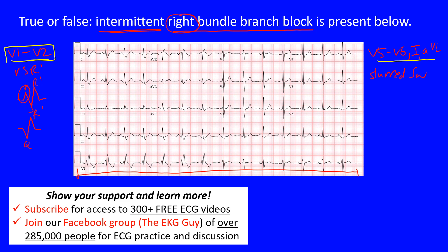Looking at our 12-lead, in V1 and V2 we have R and S waves - no RSR prime or rabbit ears. In V5 and V6 you can see slurred S waves, though they're not as prominent there. They're more prevalent in Lead 1 and AVL, where you notice this widening of the S waves. The reason we may not see it in V6 could be lead placement, since Lead 1 and V6 should normally be quite similar - so something is going on here.